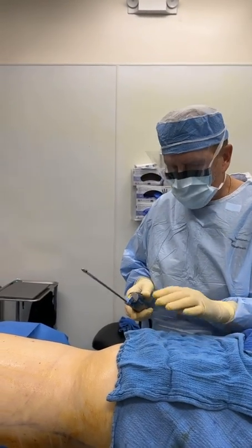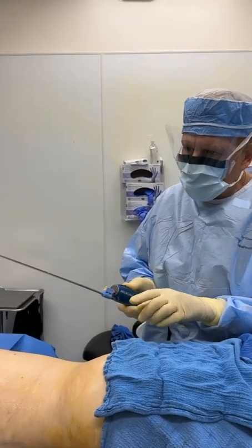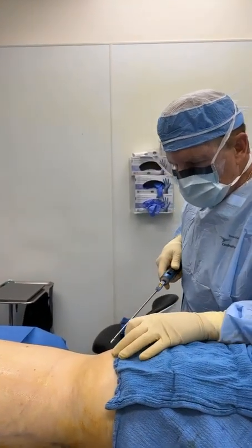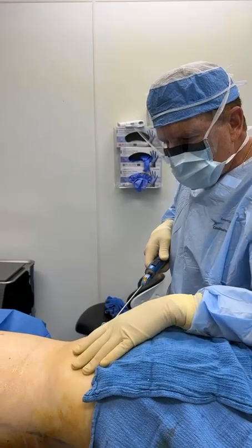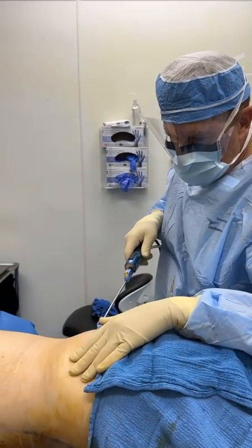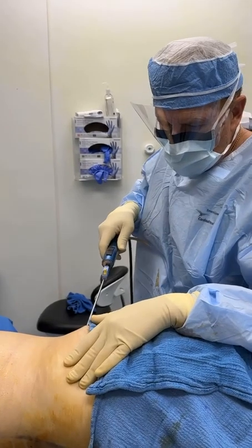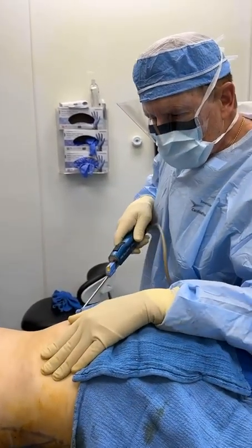We're gonna do liposuction. This is micro power assisted liposuction. Look at the tip, how it vibrates. I compare it to an electric toothbrush, right? You don't have to be going in and out at full speed, although some surgeons that have this device do precisely that. When you brush your teeth, all you gotta do is be gentle, right? Let the electric tool do its work.